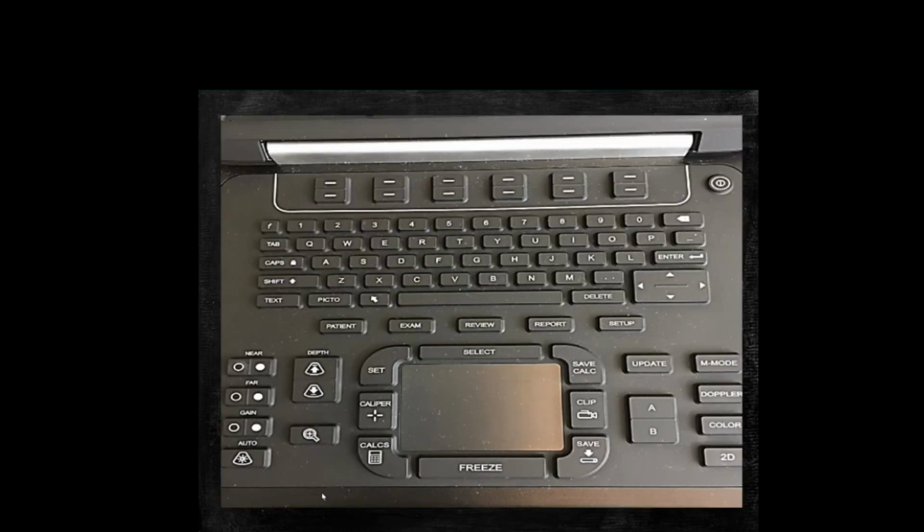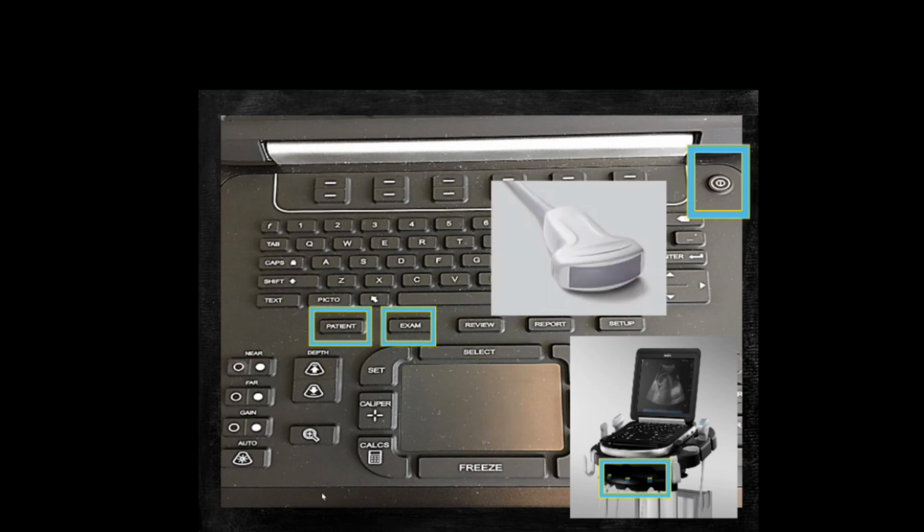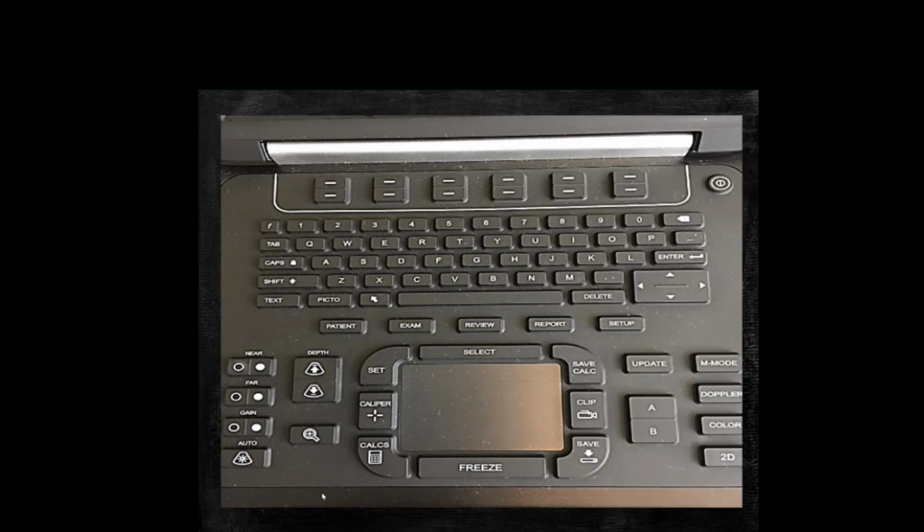All right, so let's wrap up here. We turned the machine on. We started a patient encounter. We selected the right transducer. We made sure we are in the right exam mode for the exam we're completing. And we ensured that the probe marker was in the correct location on the screen. When we are ready to optimize our image, we did depth, axis, gain. So we set the depth appropriately to center our image, at least in the middle or the bottom third of the screen. We appropriately oriented our image, and we did the gain appropriately, and then we clipped the image.